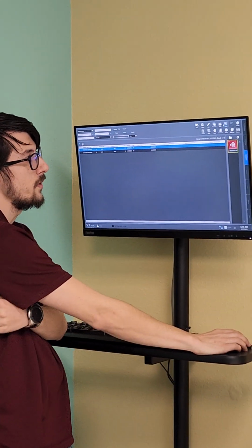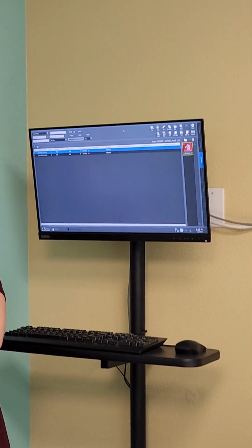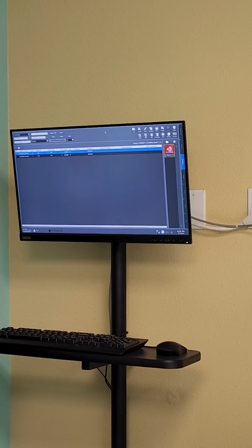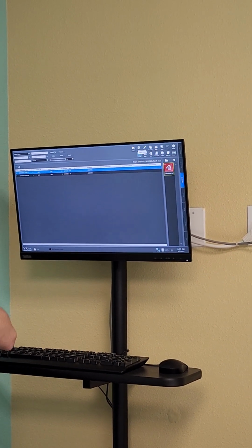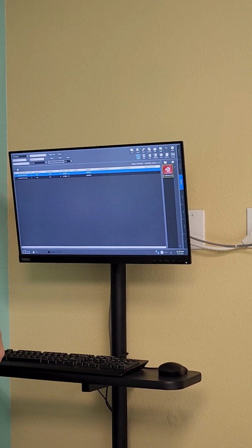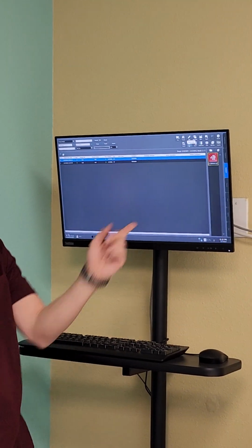Open study just opens it. Import study, that's if y'all had existing studies that y'all wanted to move into this system. Stitch, I don't think y'all are going to use Stitch. Basically, if you take multiple images of a full spine, it'll know where to stitch them all together to view a full spine. Send and multi-send. Send is just sending to PACS.